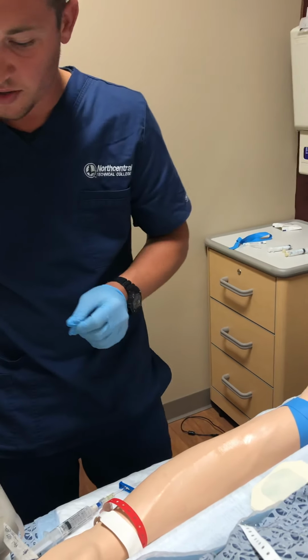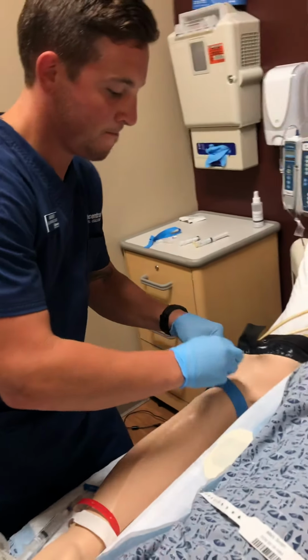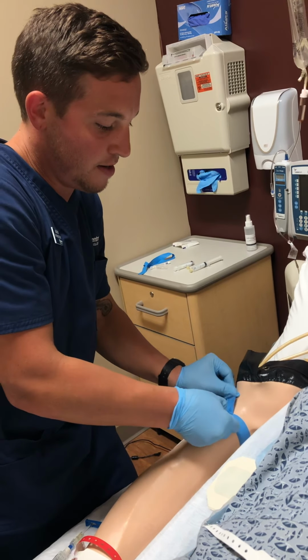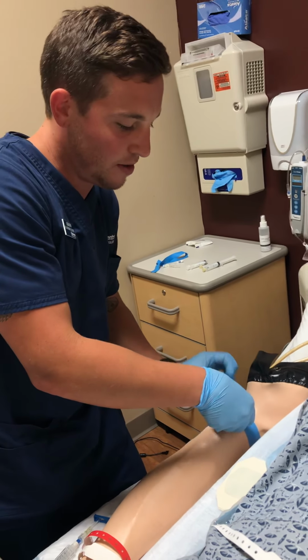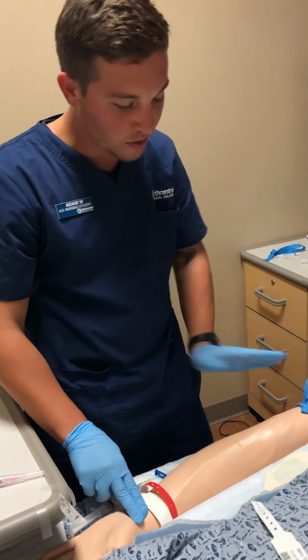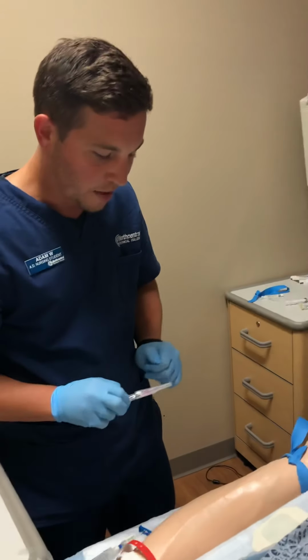Okay, so now that we have that, while that's drying, we can reapply this here. That should be the right amount of time or so. Okay, recheck. We still got that radial pulse, says no pain. So, okay, we got our site here.